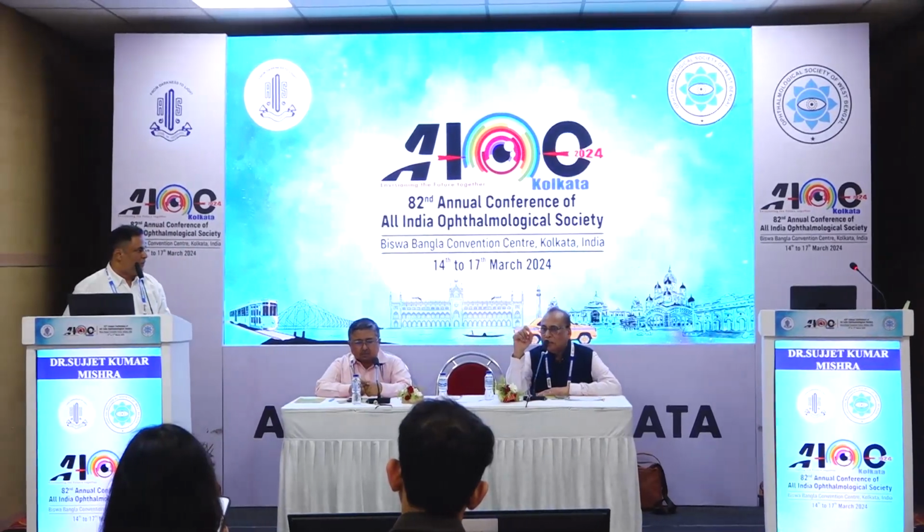Absolutely, that is why the first slide I put was myths about toric IOL. It needs a lot of instrumentation. No, the first slide was no. With manual marking, you can do it very well. And marking on the slit lamp, 0 to 180 degree, with a 26 gauge needle, gives you a precise axis. So that is one thing which I have learned, that there's hardly any difference in the ultimate result between a manual marking system and the other. I didn't add the video because of lack of time, but I just passed by mentioning 3-point marking.